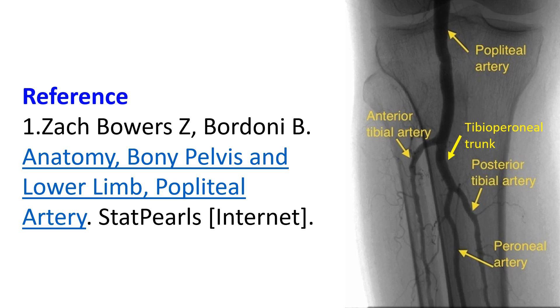Geniculate arteries arise from the popliteal artery at multiple levels, providing blood supply to the knee joint and adjacent structures. They also contribute to the collateral blood supply to the lower extremity.